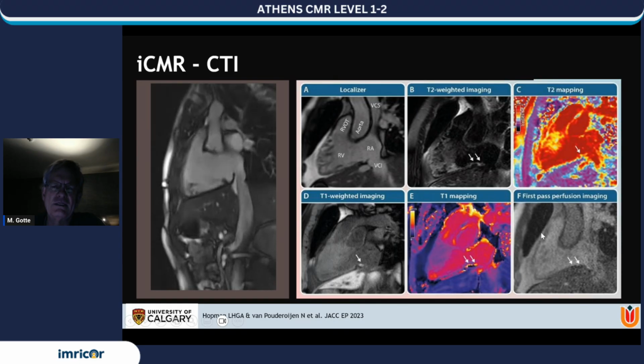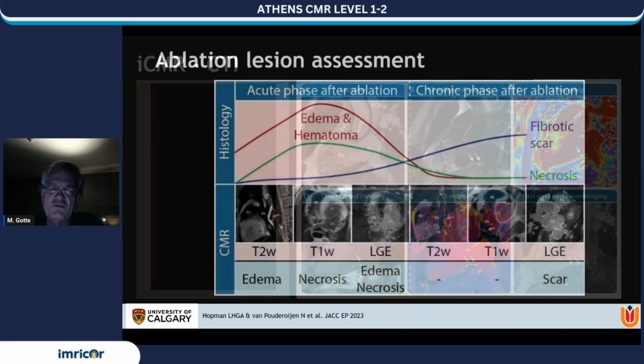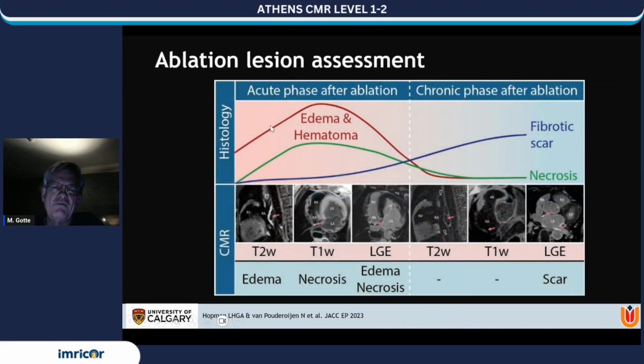So I think that MR will become an important support tool, instrument, way of ablating patients to improve the quality. And we also look at the different phenomena over time related to ablation creation to better understand how we can create durable lesions in one episode of ablation.